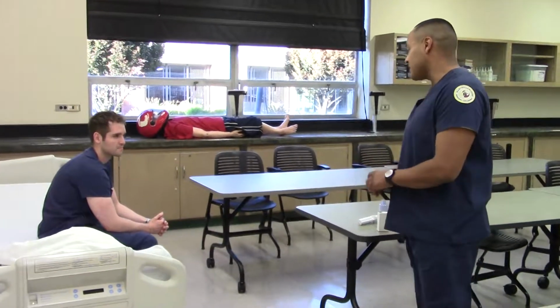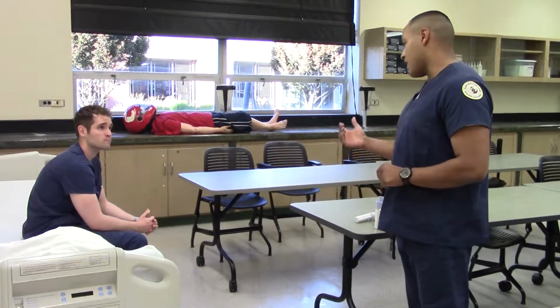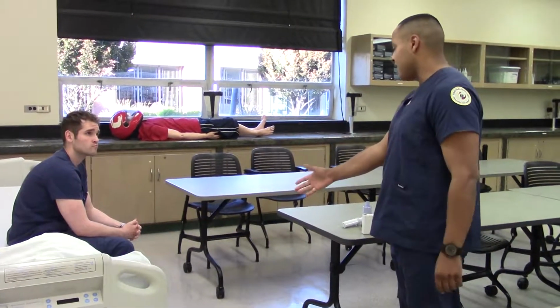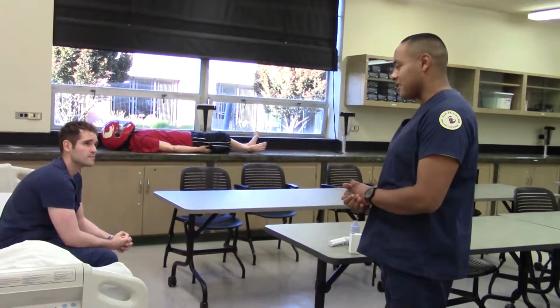Hi, how you doing? My name is Rich, RT. Daniel? You Daniel? Okay. I'm here, your doctor ordered an albuterol treatment. What albuterol is, it's going to help your lungs open up wider. It helps you breathe. How are you breathing right now? It feels a little chest tightness, a little hard. Little chest tightness? Okay. We'll get that situated.